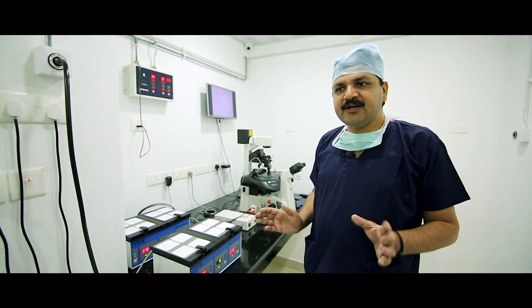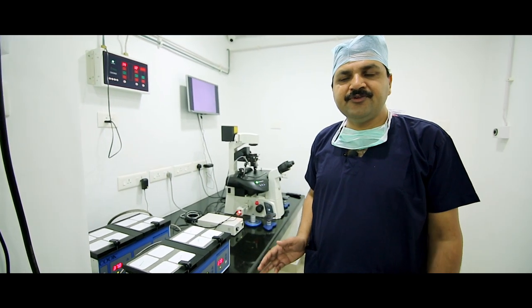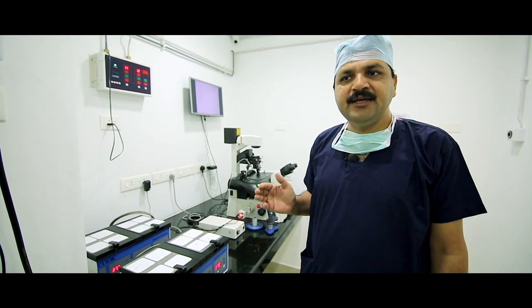If IVF failed — due to low fertilization or total fertilization failure — the next technique is ICSI.